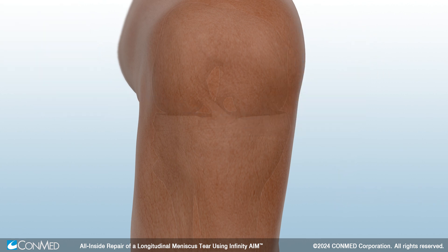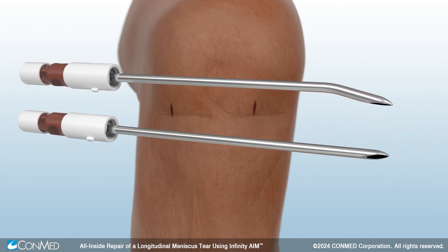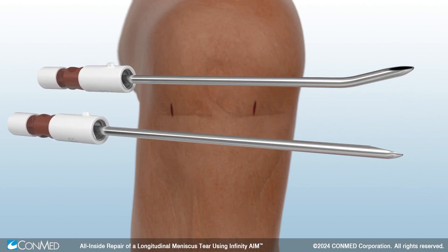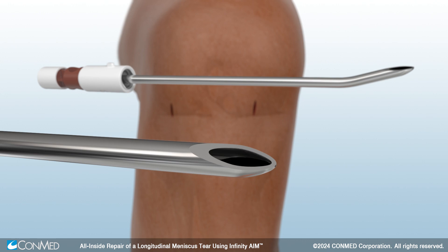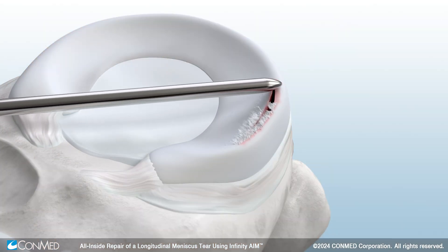To begin, create vertical portal incisions for improved joint access. Use ConMed's Lanza shaver blade, available in straight or pre-bent 15-degree curve options, to clear the soft tissue and resect frayed edges along the tear.